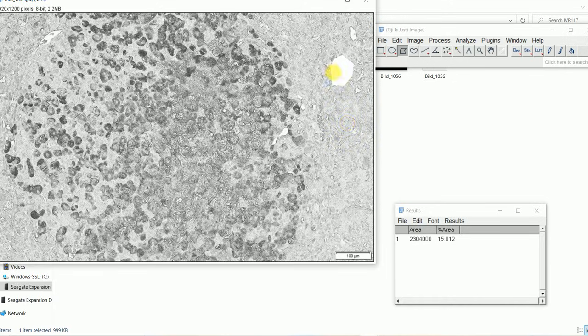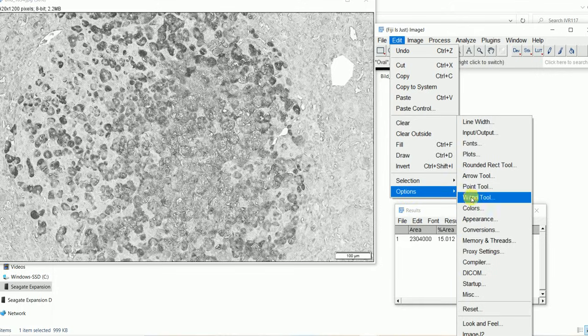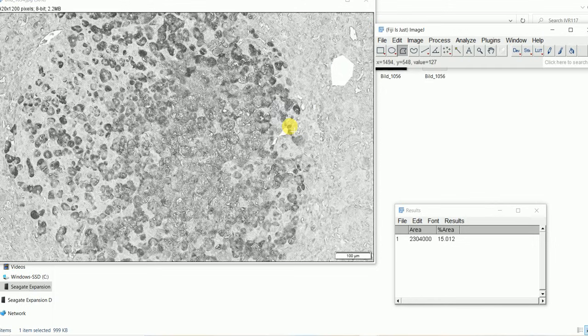I already showed you how to make this one white. To make it white, you will go to edit, then options, then colors, and in the colors you have to select white and white. These two things have to be white and white, then only it will appear white. Just press OK to show you. Right, so now we can quantify this image.